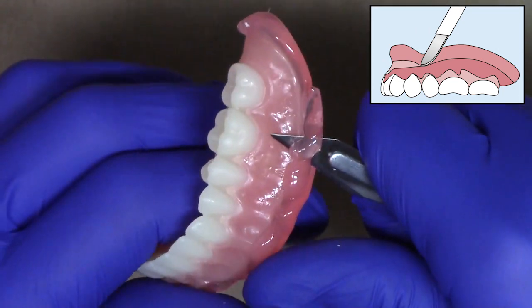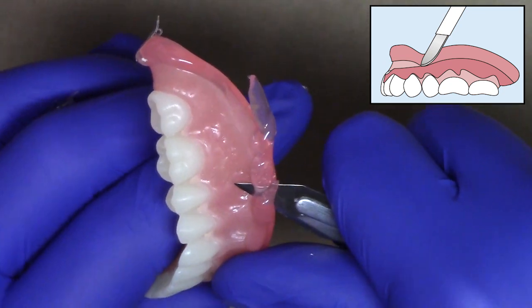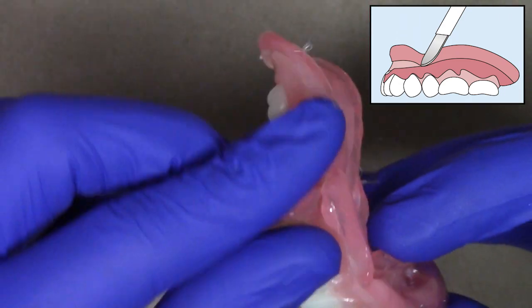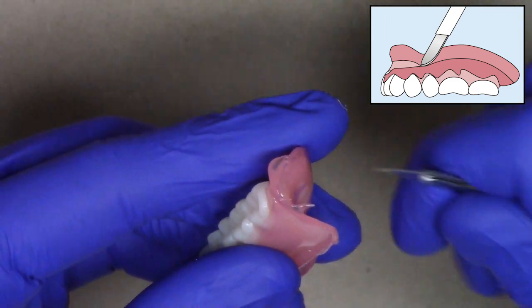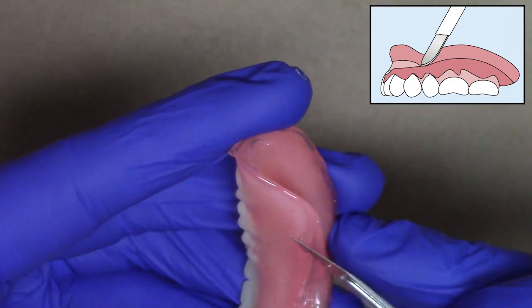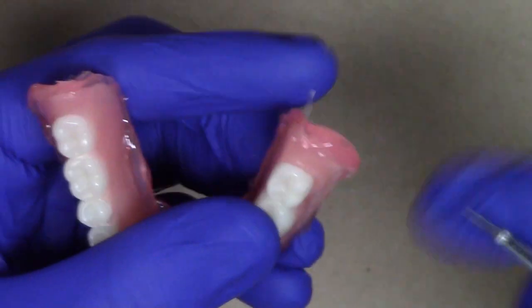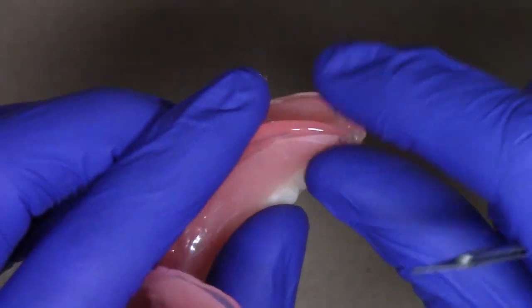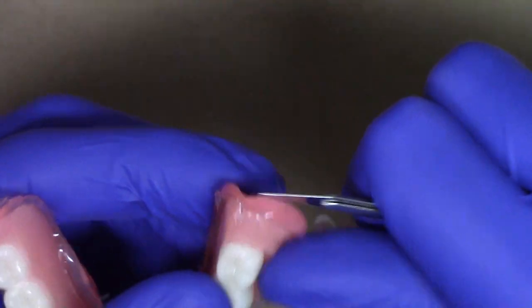There we go. And I usually like to hold it at that angle just so that way it'll clean up nicely. And just peeling it apart as it cuts. Cleanup here is really pretty much a breeze. With this material, you'll see how easy it is to clean up. The most important thing is you want to make this comfortable for the patient to keep in his or her mouth. You're looking for any areas of just these little fins, any areas of sharp show through.